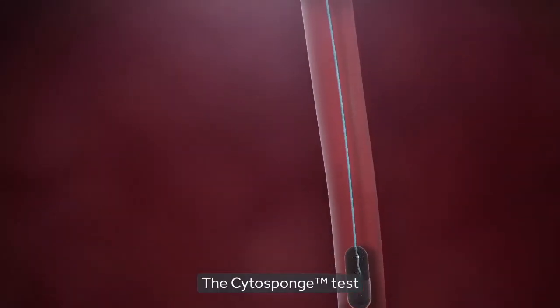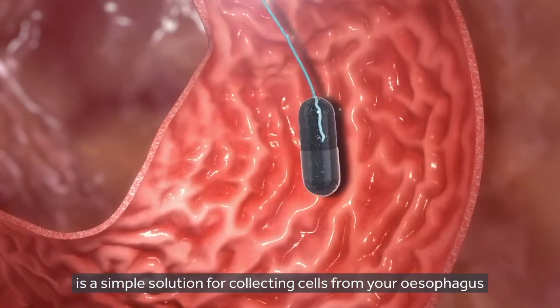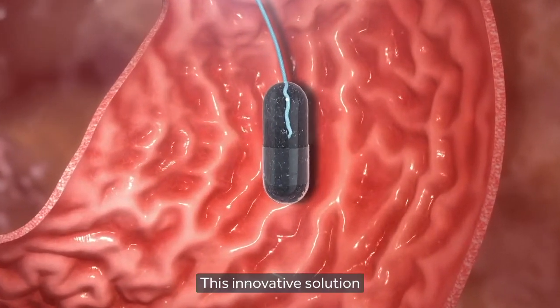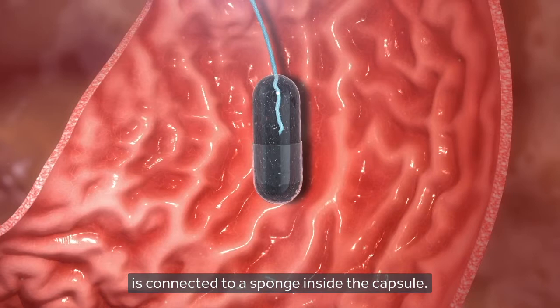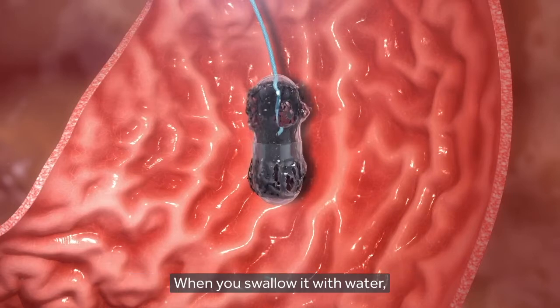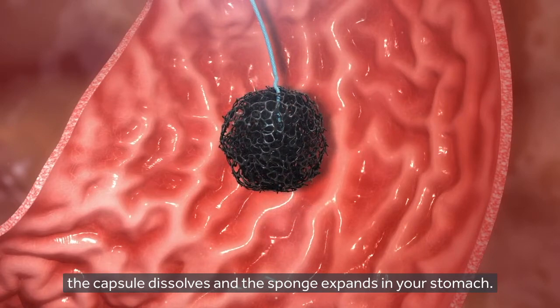The Cytosponge test is a simple solution for collecting cells from your oesophagus, or food pipe. This innovative solution uses a small capsule-shaped device the size of a multivitamin pill. A thin string is connected to a sponge inside the capsule. When you swallow it with water, the capsule dissolves and the sponge expands in your stomach.